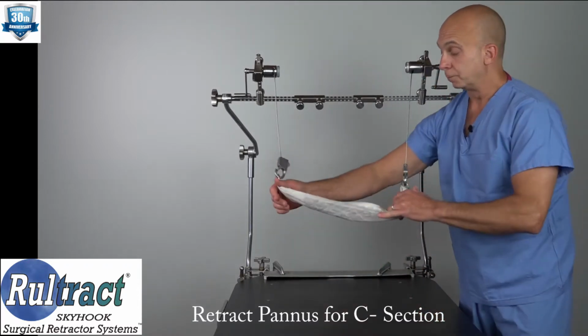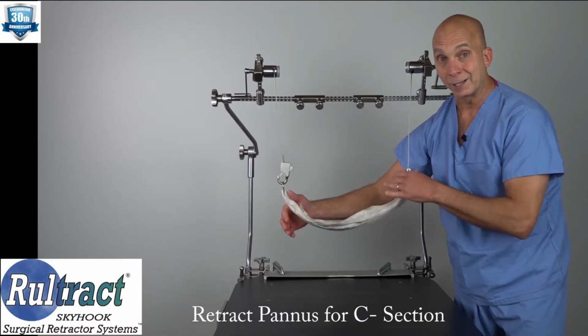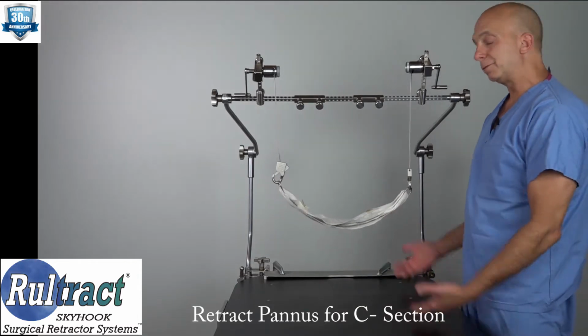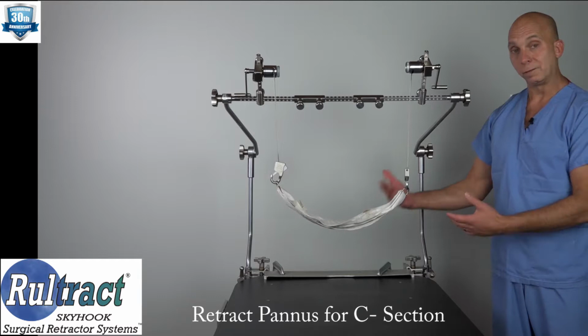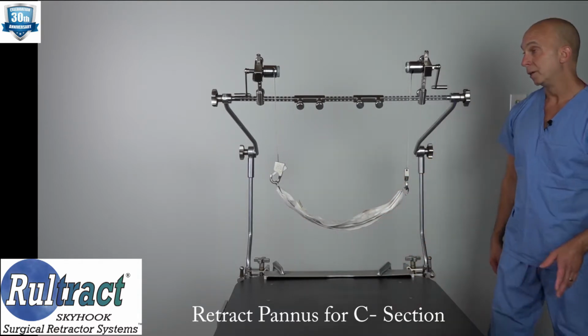I'm not sure. Something else, of course, that I said is if we rolled the pannus back, but we don't want to do that because we don't want it on her chest. So we have to find a way to suspend it and keep it off of the patient. I understand that. This is something that I just came up with.